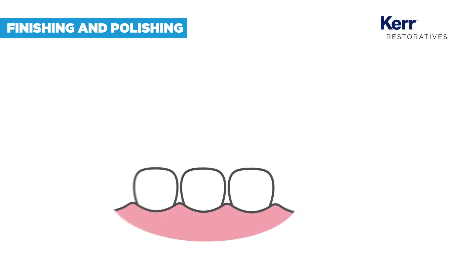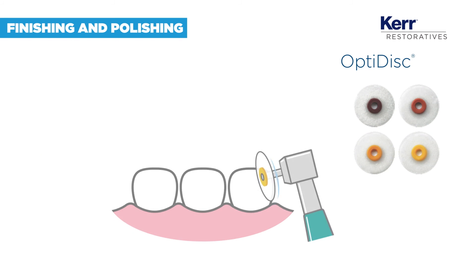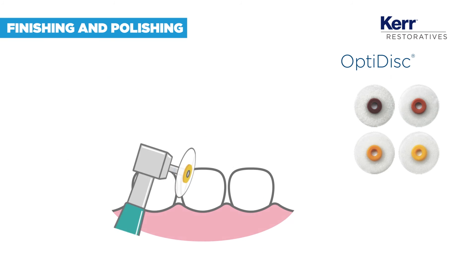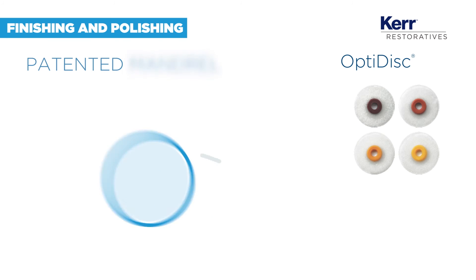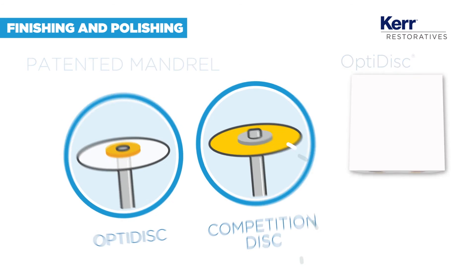The last step is to give your restoration a great finish and polish. OptiDisc finishing discs offer different color-coded grit levels. Their bendability allows you to reach even restricted areas, while the patented mandrel avoids teeth scarring and scratching.